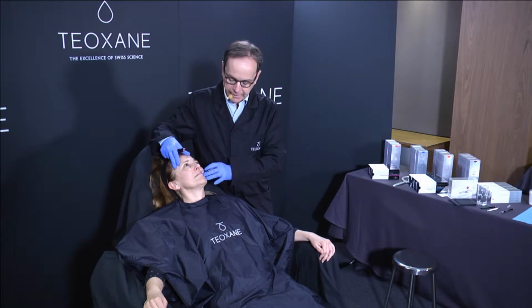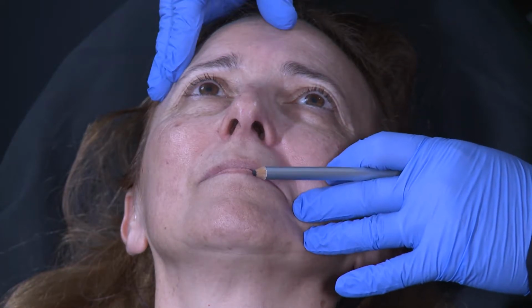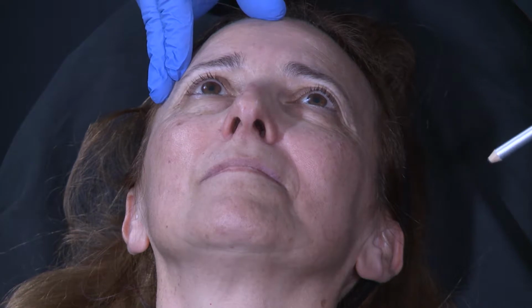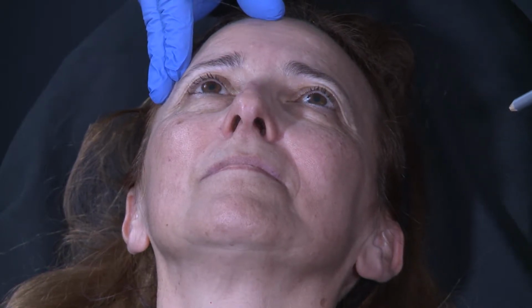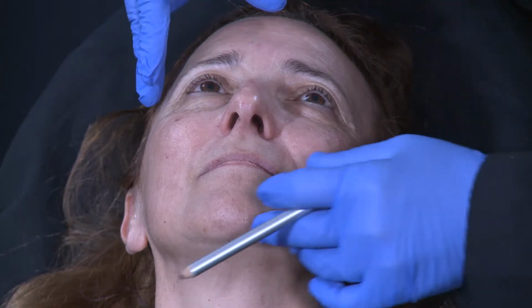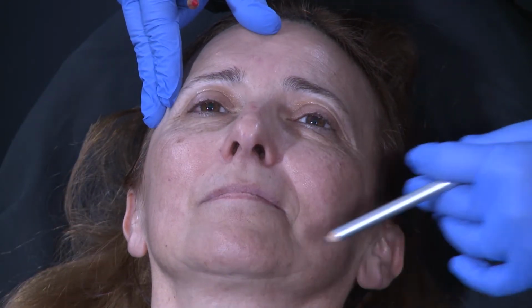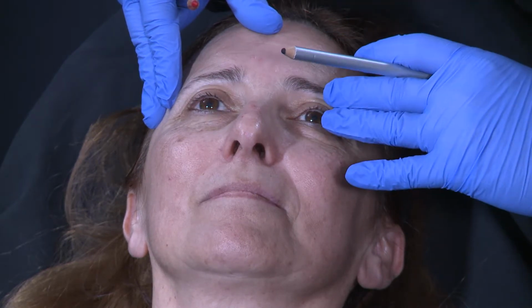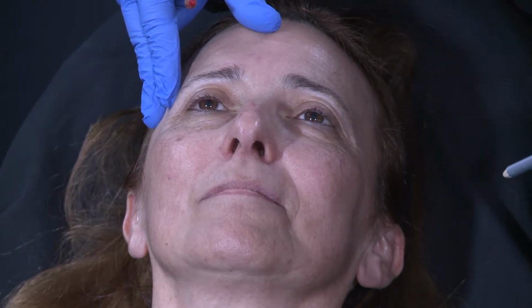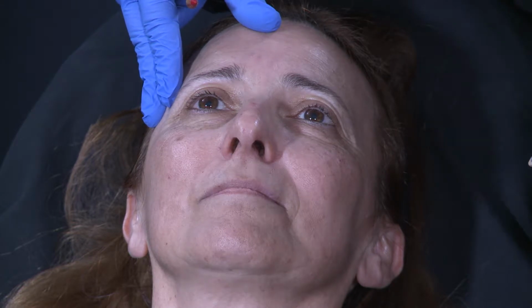So first, I do a technique called ATP. It means first, I will show you the anatomy on the patient because I want to have the safety first. Then T will be the technique I will choose. And last, the product. So it's always, for me, the same order. When I inject my patient, I just want to show you first the anatomy, then the technique I will choose, and last, the product. And not first the product, then the technique, and last the anatomy.